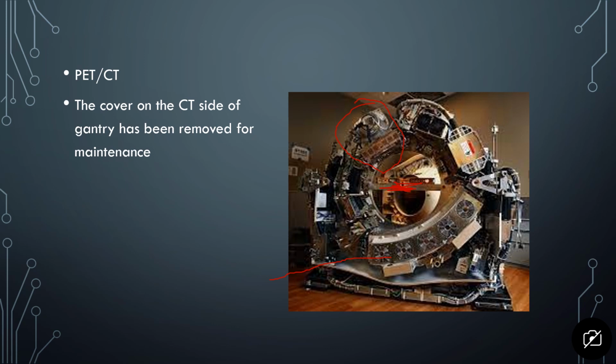These always stay opposite of each other, and then they just rotate around the patient. All that other stuff in there is a mix of electronics and mechanics, because that does travel at a very high rate of speed. If you ever get a chance to see the CT operating with the cover off, it travels very, very fast.